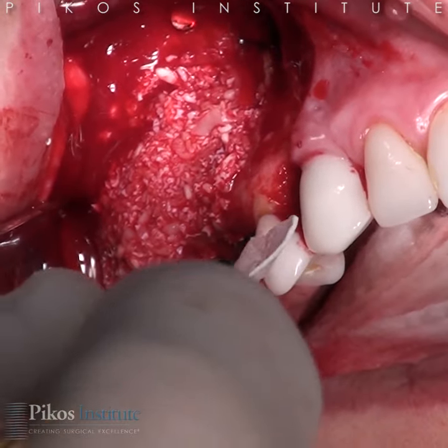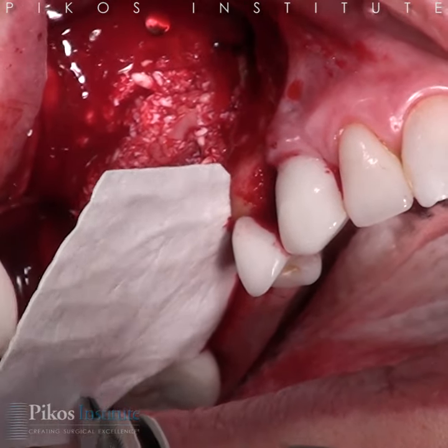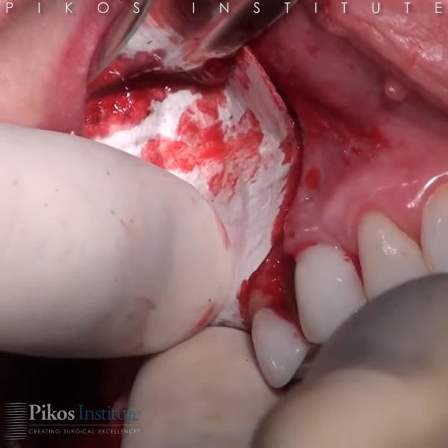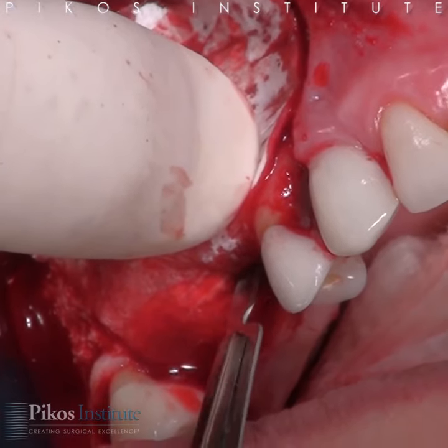There it is, into the pouch. Now I'm going to adapt it on the buckle. It may be a little long — I can certainly cut it. Before I go any further, I'm going to go ahead and place my abutments. We're going to make a little stab incision into that membrane first, using a 15-C blade.